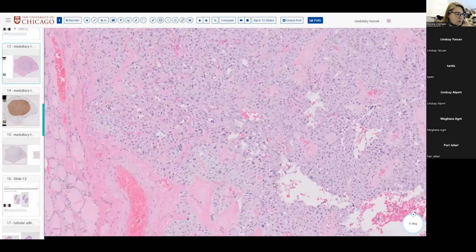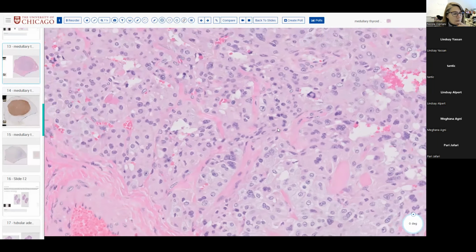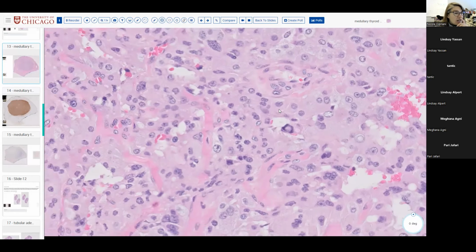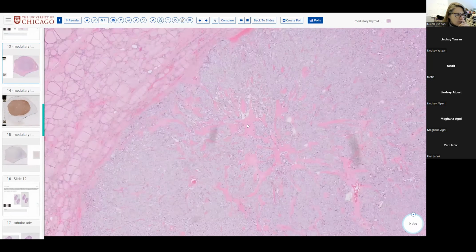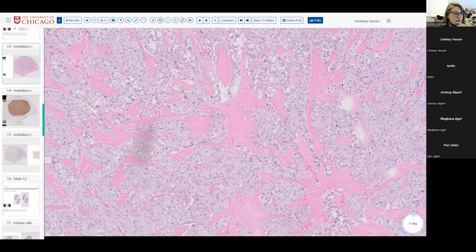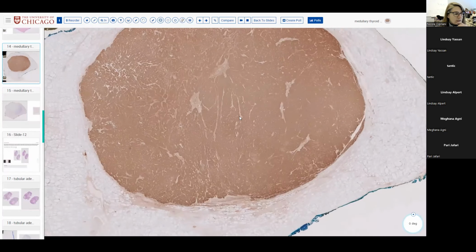There are a few other things that we see in medullary, including some random endocrine atypia with some of these larger, wonkier, bi- or quadrinucleated cells here. Medullary can, on rare occasion, have inclusions, or at least inclusion-like cells. And then this pink stromal material in the background should at least raise the possibility of potential amyloid. So if you wanted medullary at some point, you got, if not full, at least partial credit if you had it in your differential.